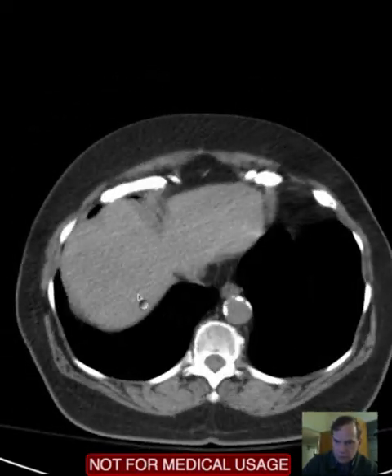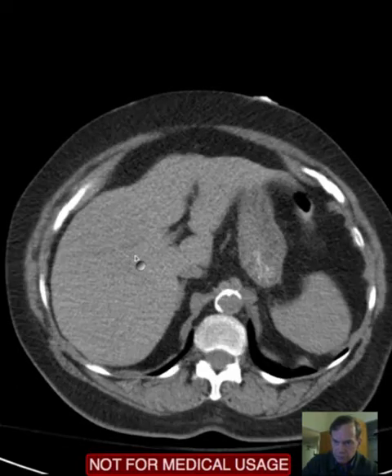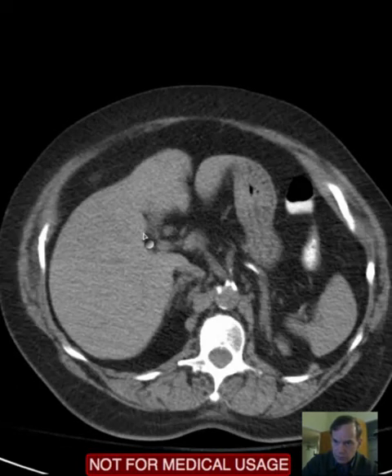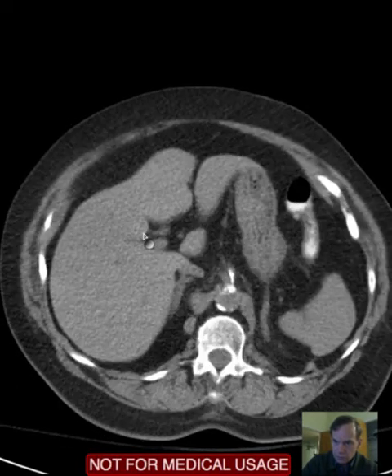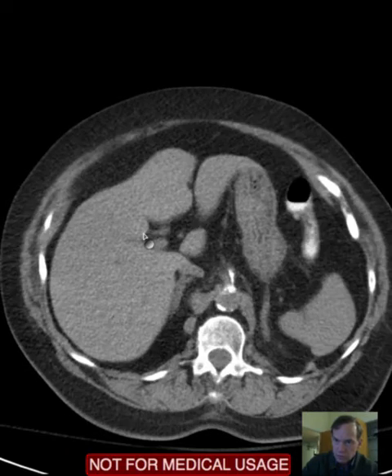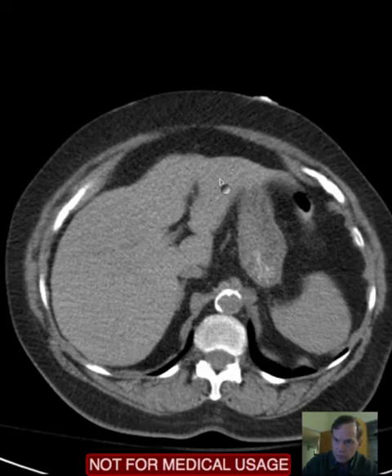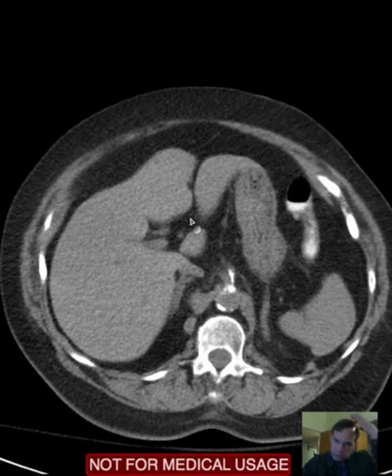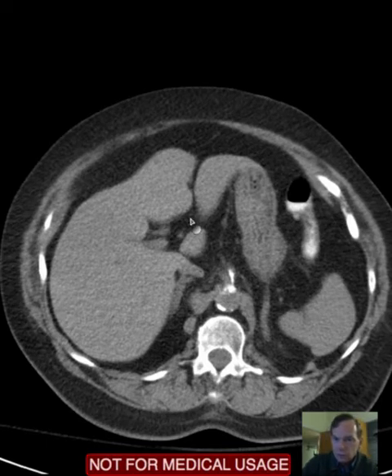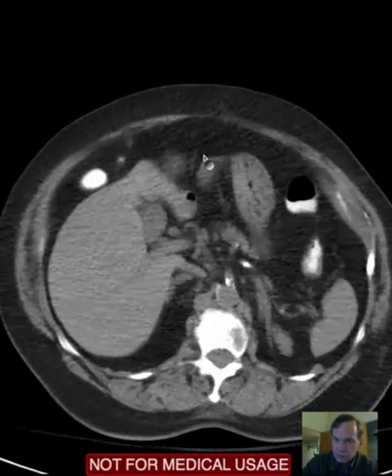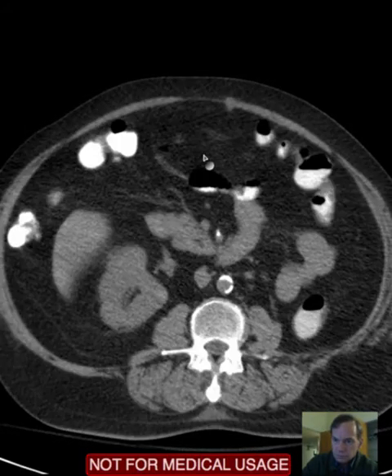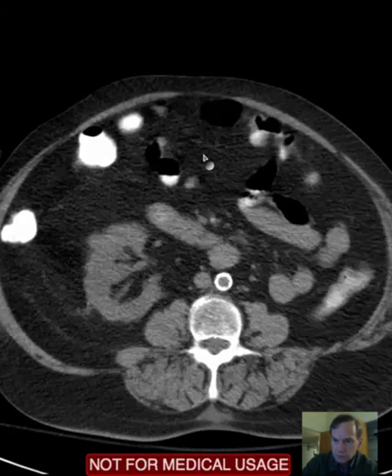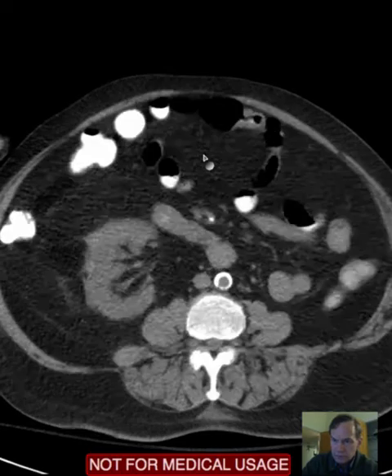Here you can see the liver. This is a cleft in the left lobe of the liver known as — that's where the falciform ligament lies.